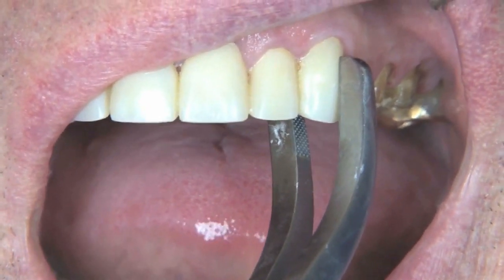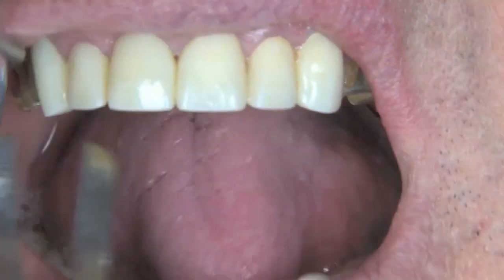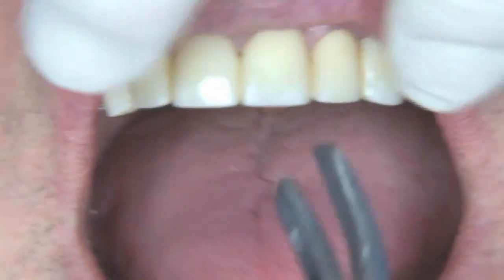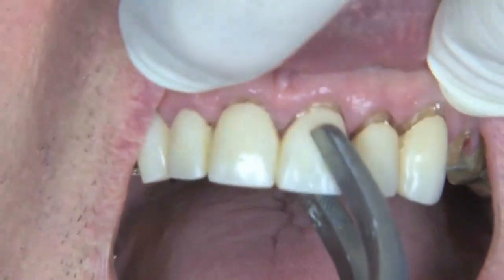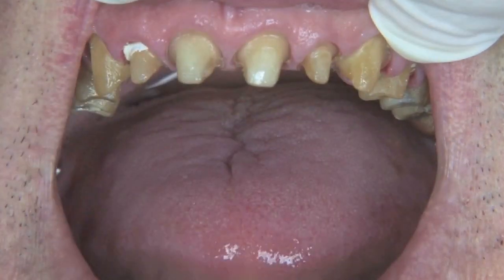Anterior, easy. You grab it, very little buccolingual movement. It's pulling and just a little bit of buccolingual movement. Watch up at the margin. As soon as you see the margin move, you know it's not cemented. Then just keep going to the adjacent tooth and back to the adjacent tooth. And any place you see it binding, make sure that's where you go and pull. And in a matter of less than a minute, all those temporaries are off and the preps are basically clean. All done with those Miltex carbide tipped hemostats.